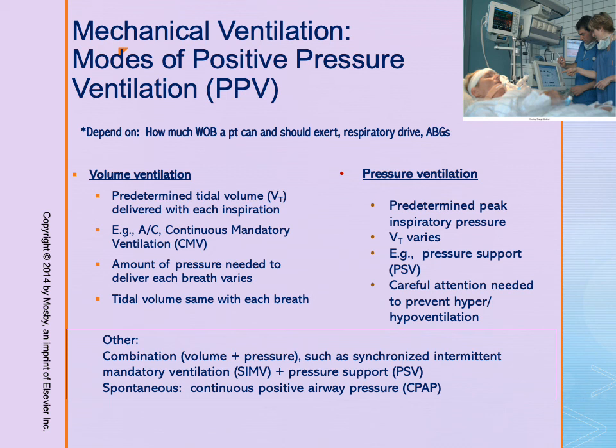To review, with pressure ventilation, the patient receives a preset amount of pressure with each breath that they initiate. The tidal volume will vary based on the amount of positive pressure that is used and the lung compliance.